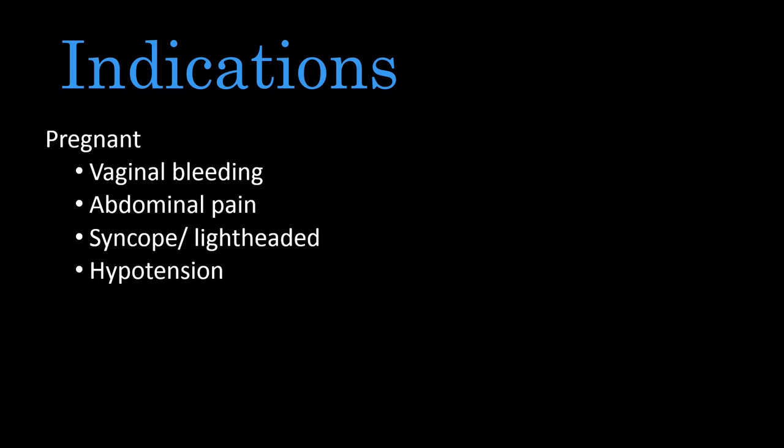So indications for this procedure include pregnancy or suspicion of pregnancy with vaginal bleeding, abdominal pain, syncope, lightheadedness, presyncope, or hypotension.